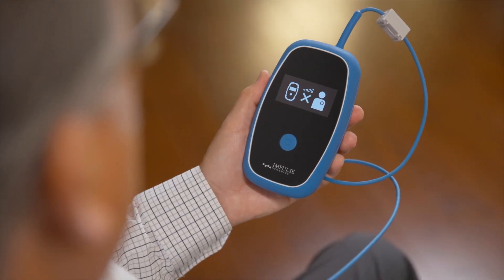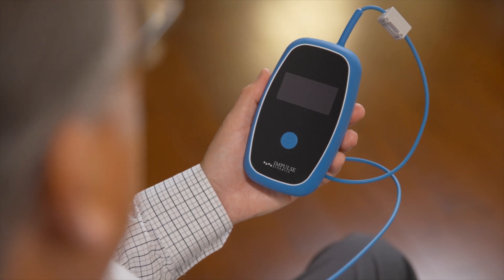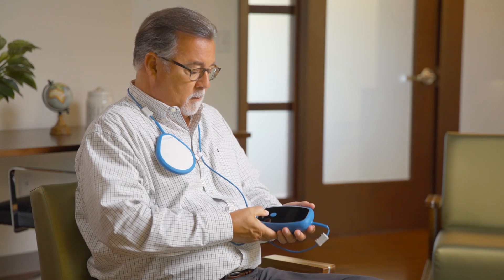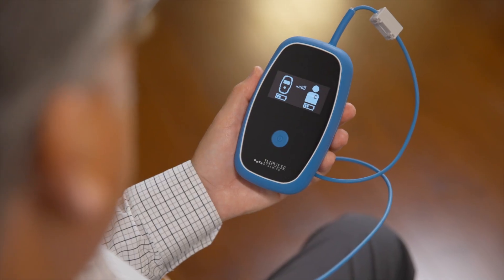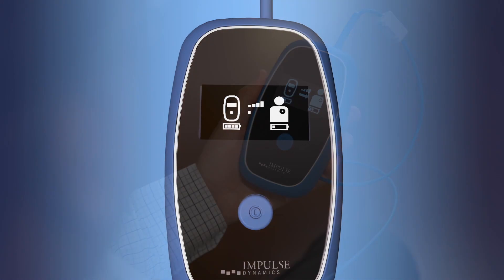However, if the charger powers down, press the power button and start again. When the moving arrow is displayed, your Optimizer has started charging.